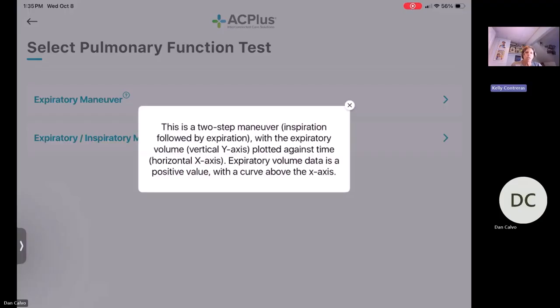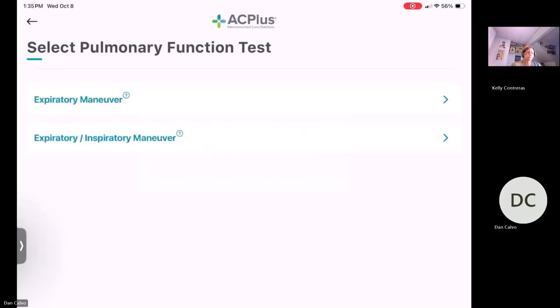Okay, and so the Global Lung Initiative uses 4 very specific criteria: age, gender, height, and ethnicity, to run through the algorithm to see where the patient's actual FEV1 and FVC percentage matches up with their predictive norm.